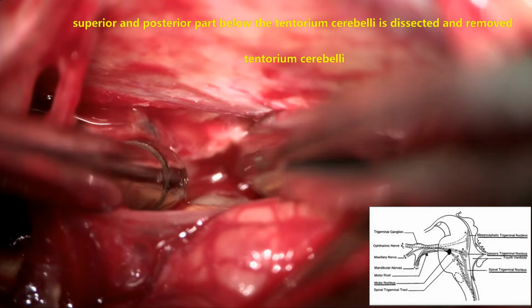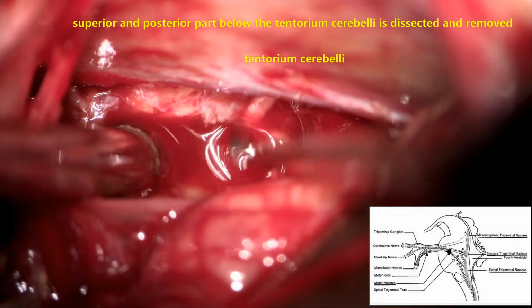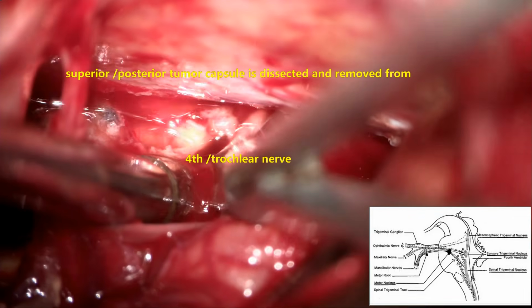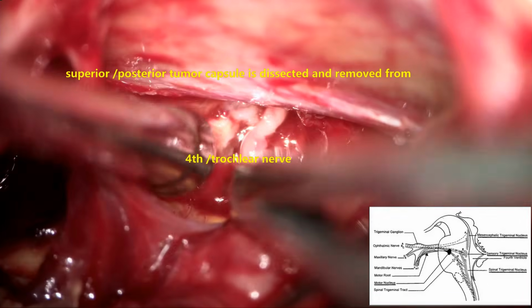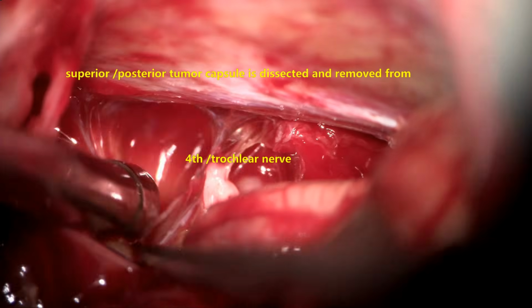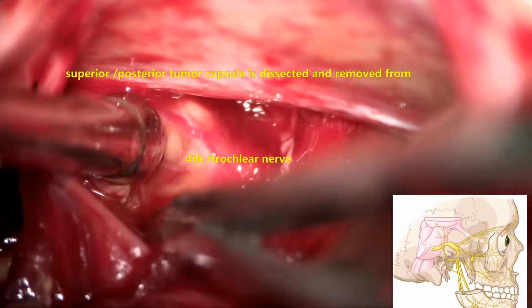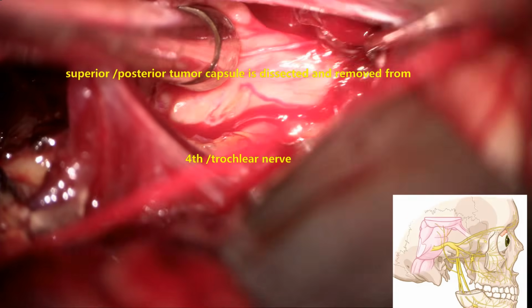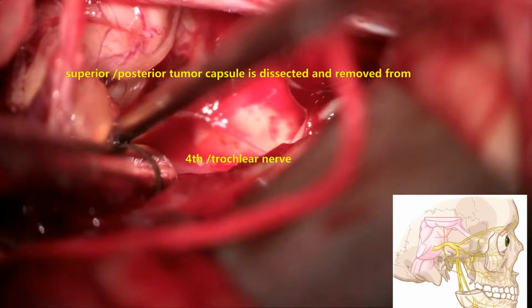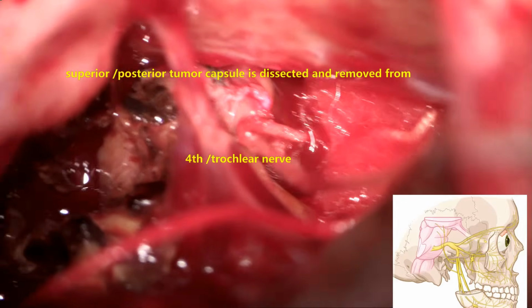During this process, the trochlear nerve, posteriorly originating from the midbrain, comes into view, and you can see that it is densely adherent to the capsule. With sharp dissection, this nerve, the trochlear nerve, fourth cranial nerve, is separated and pushed superiorly and posteriorly away from the operating field, and the tumor capsule is gently brought down and taken out. This takes some time and needs to be done patiently. Under any circumstances, the trochlear nerve should be preserved and protected.